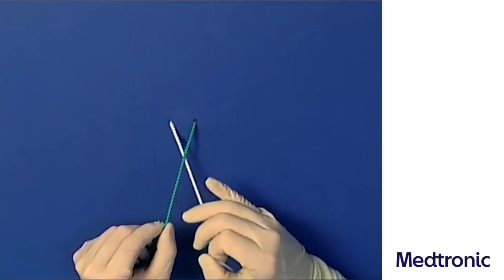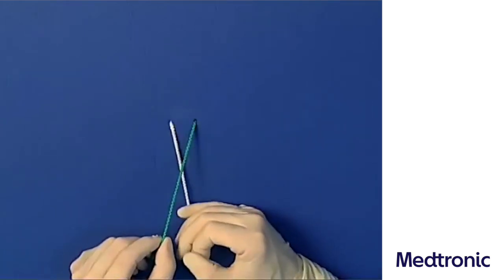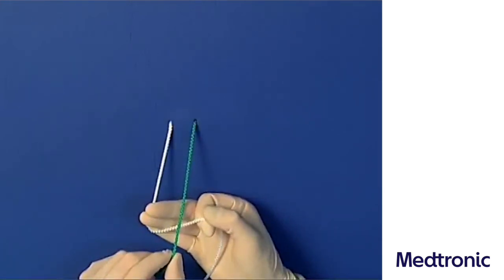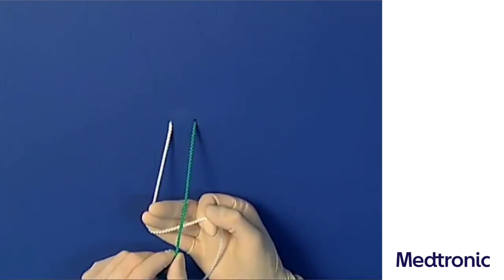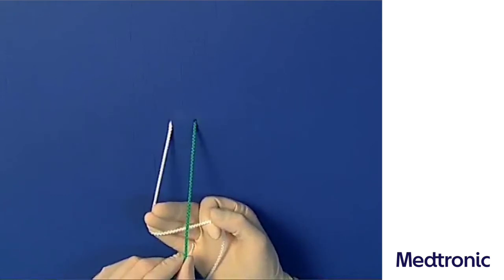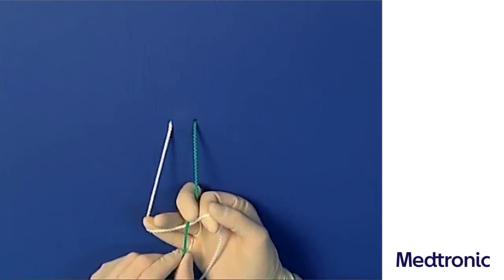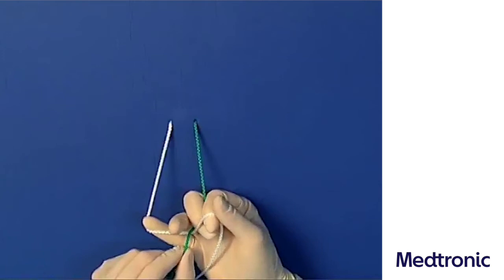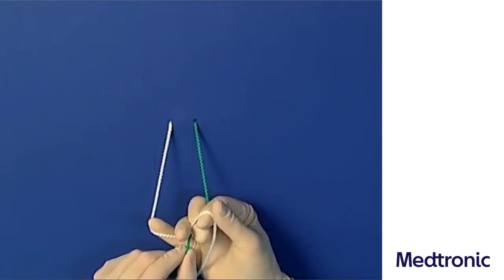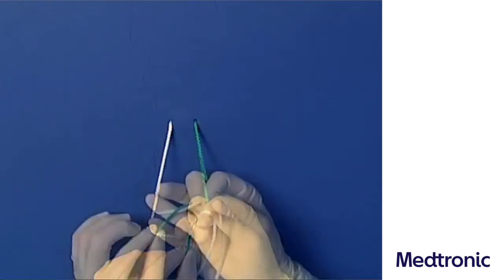The right hand thus describes a supination movement. The left hand applies the right suture part primarily over the right middle finger. The sutures then cross each other. The right suture part is now led underneath the left end by using the end phalanx of the right middle finger and clamped between the right thumb and ring finger. The fixed suture is now led through the pulling thread, forming the first loop.